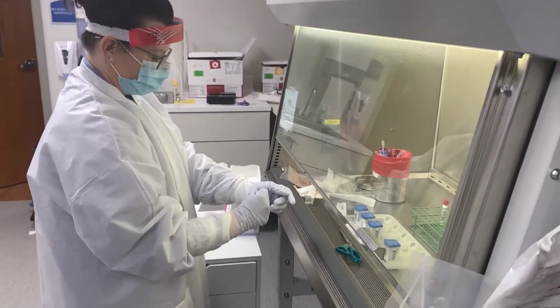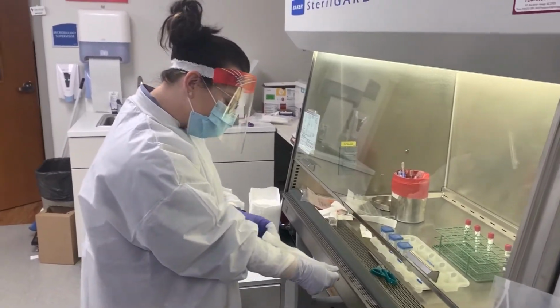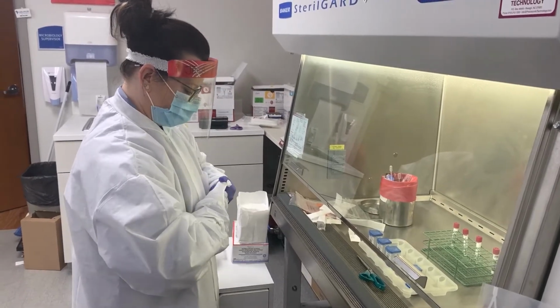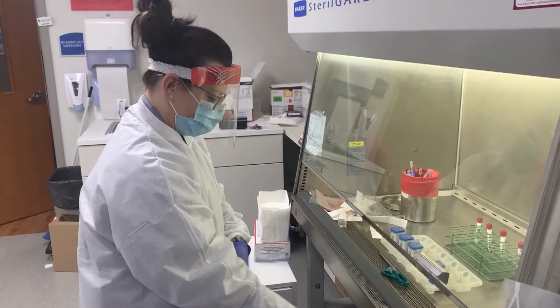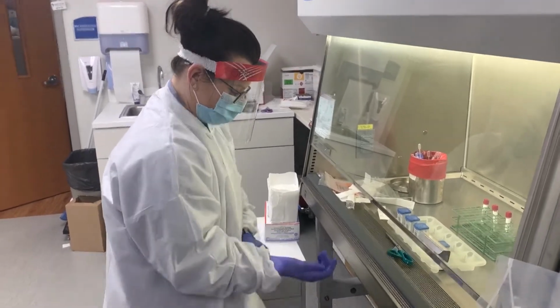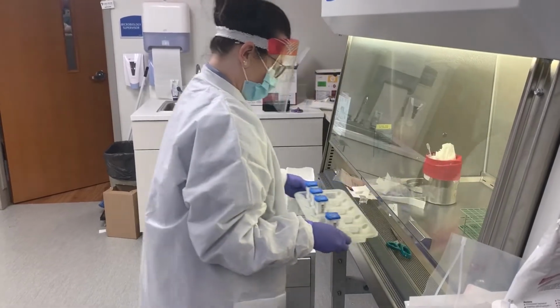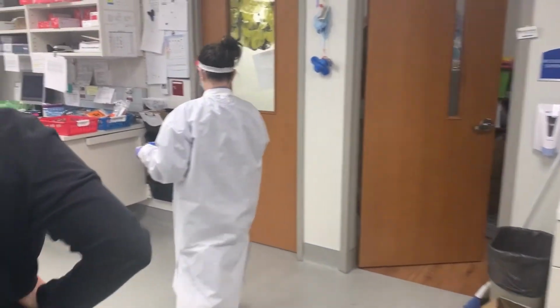Now that Jess is done setting up her test, she is going to first remove her gloves. And now we are going to go place the test on the instrument.